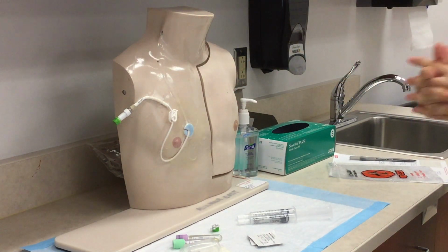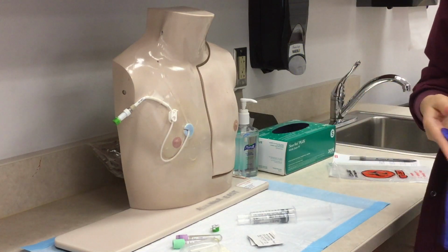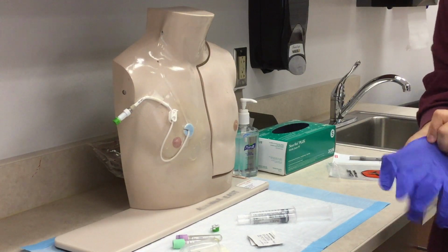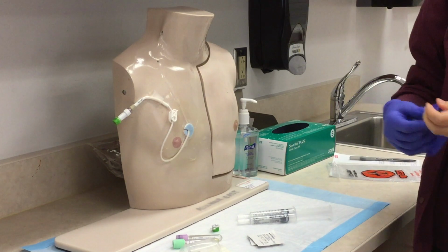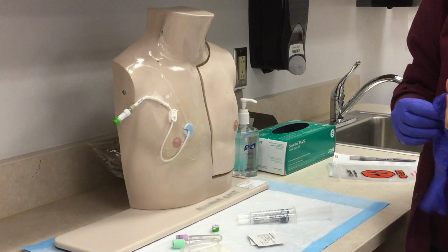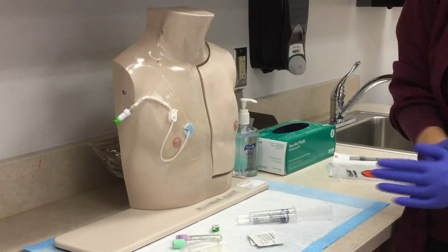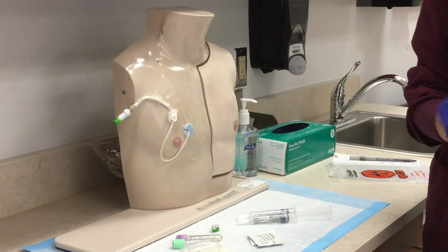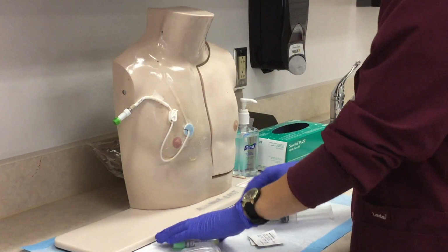And then begin to assess the central line insertion site. Always assess the insertion site prior to accessing, observing for any redness, warmth, tenderness, swelling, or drainage. Inspect the catheters for kinks or tears and the hubs for cracks. Ask the patient if there is any pain at the insertion site. Do you have any pain right around this insertion site, Mr. Chester? No. Good. When there is more than 1 lumen, choose the most distal lumen for blood samples.